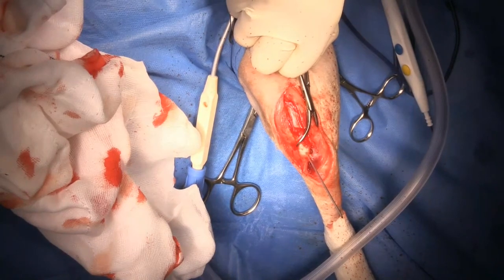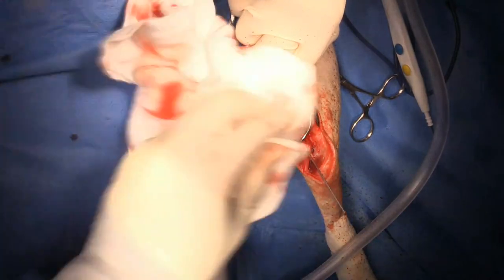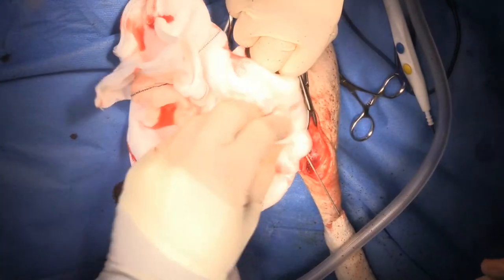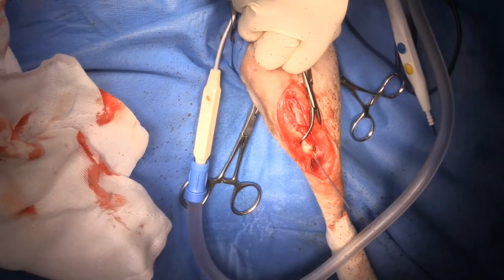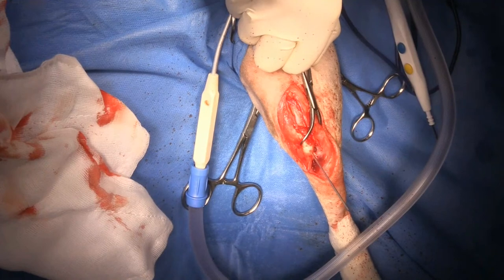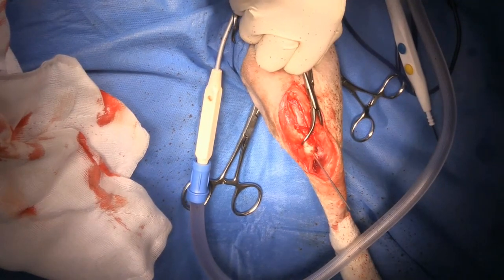If I did have a ruptured cruciate ligament, I would go ahead and do an extra-capsular repair at the same time if I discovered it in surgery. If I was aware of it preoperatively, I might think about doing something like a modified TPLO, a TTA, a closing wedge, or a cora-based TPLO.